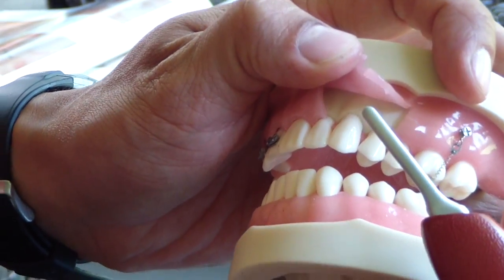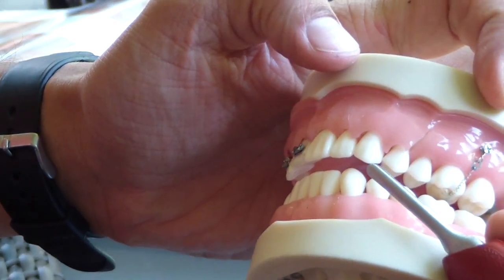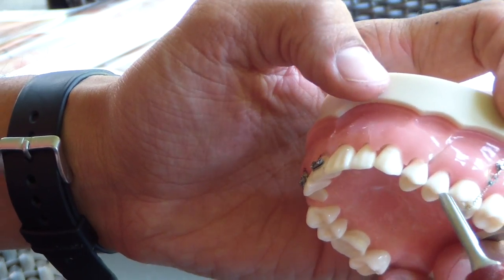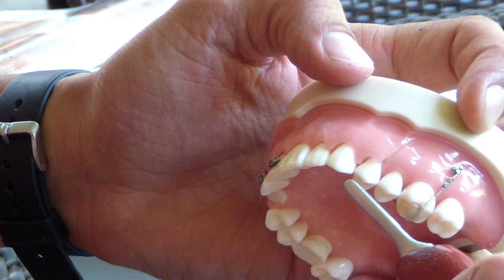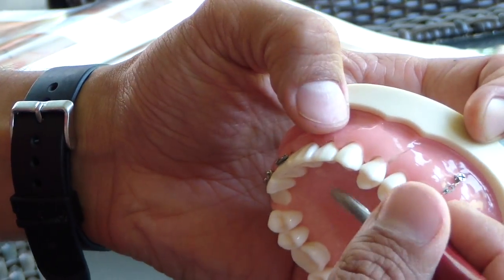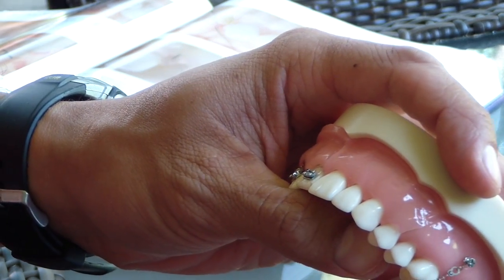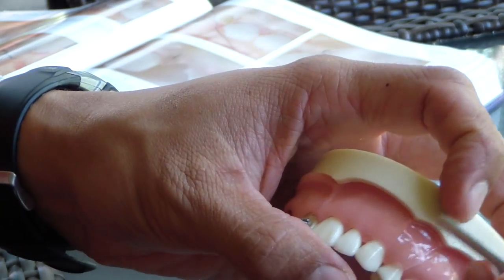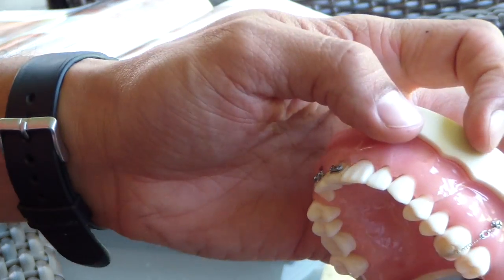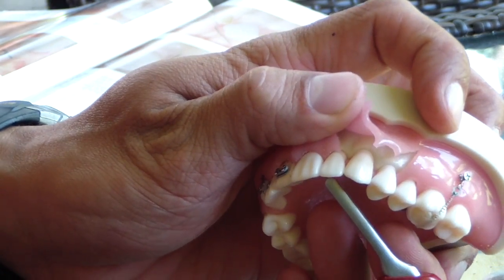What we want to do is ensure that when we re-approximate and coronally reposition this flap, those papillas — because this is becoming more in the aesthetic zone, whether you consider that canine-to-canine or bicuspid-to-bicuspid — are held in place. As humans, we want to control the situation as best as possible. Instead of using just interrupted sutures, which would sort of push down the papillas, when the patient's talking — even on a soft diet — the movable unattached mucosa is still moving. So we want to keep those papillas — meaning the palatal portion and the facial portion — together.